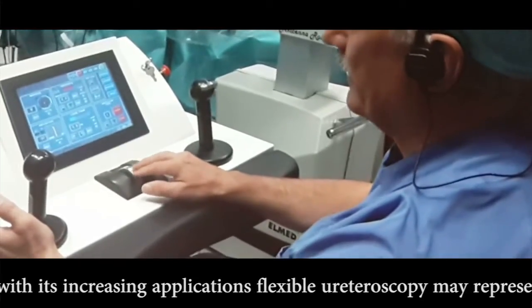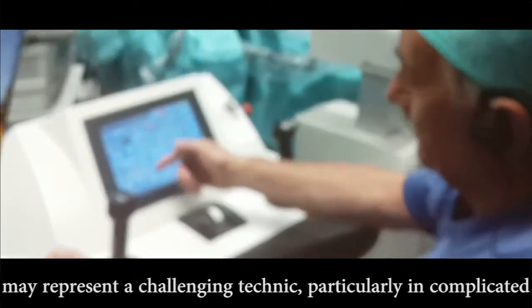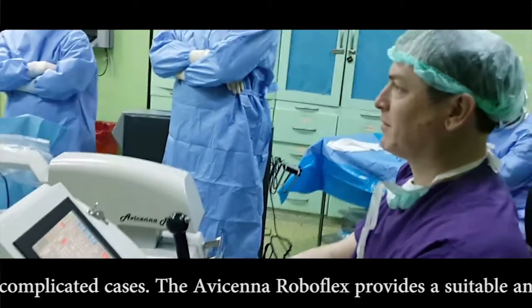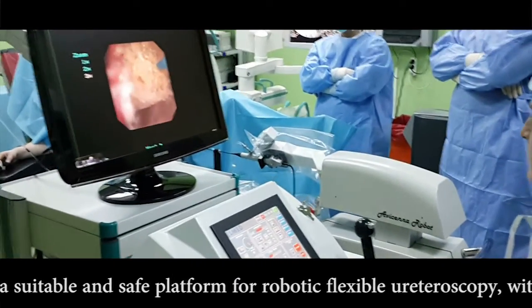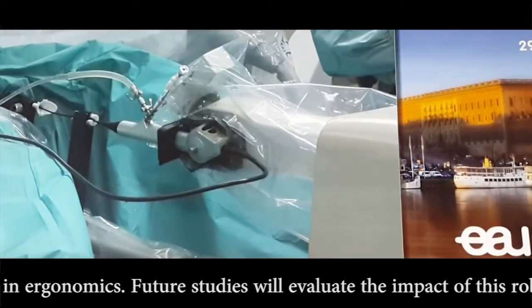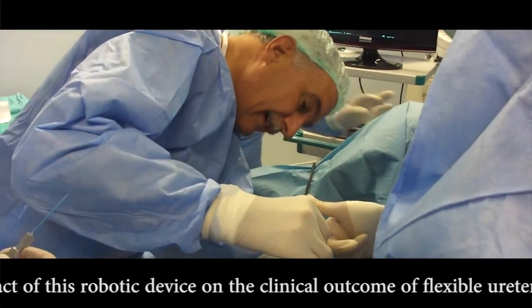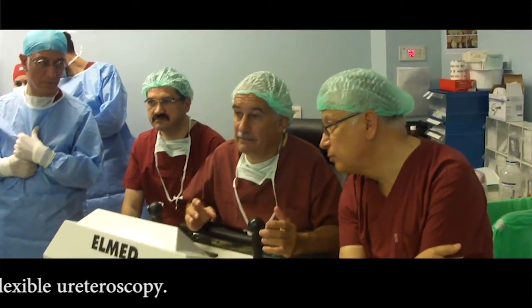With its increasing applications, flexible ureteroscopy may represent a challenging technique, particularly in complicated cases. The Avicina Roboflex provides a suitable and safe platform for robotic flexible ureteroscopy with significant improvement in ergonomics. Future studies will evaluate the impact of this robotic device on the clinical outcome of flexible ureteroscopy.